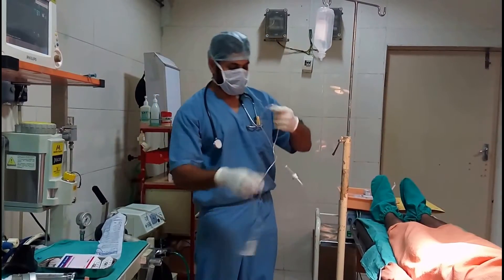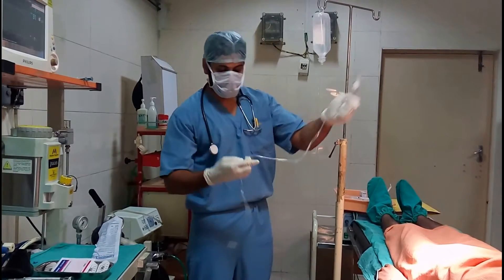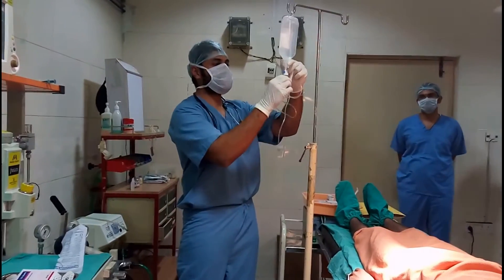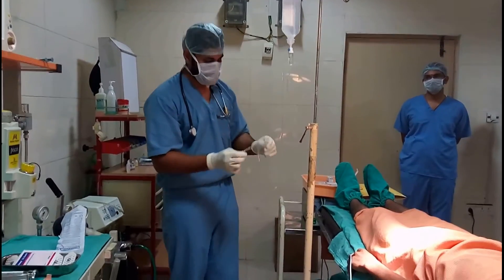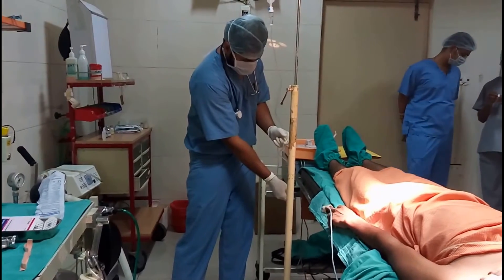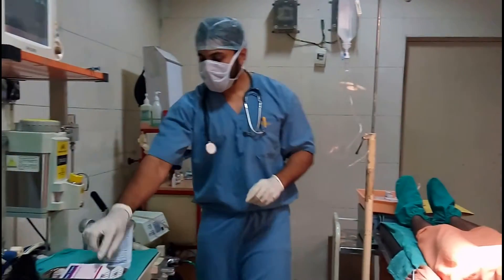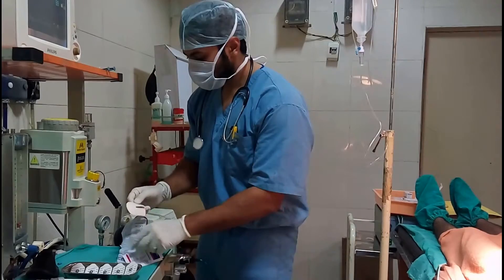Because it always carries a chance of air embolism. By default, all the IV lines are open — fix it up and drain down the air. This drip set is ready. Step 2 is to proceed with the cannulation process.